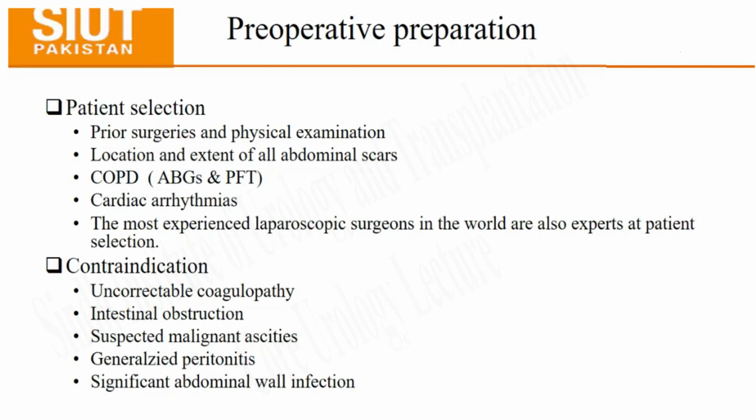The one disadvantage that Dr. Haris Jamil pointed out about the robotics was the lack of tactile sensation. What do you think? What difficulty or what problems you can face if you don't have tactile sensation while doing surgery, as compared to open surgery or laparoscopy? What do you think? What could be the drawback or limitations when you don't have tactile sensation while doing surgery? Anyone?